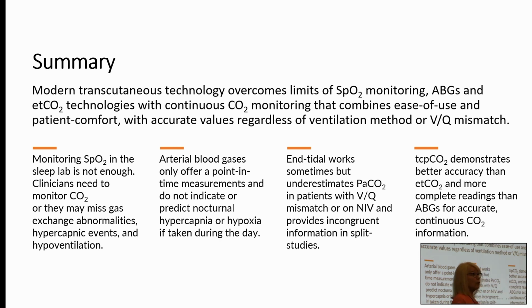If you have a patient who's got skin issues, then that is something to take into consideration when you're monitoring that patient. So it may be that you need to check that site once, or if they're sensitive to any type of heat, you would take that into consideration, just like you would all the other things that you put on your patients. It's not magical. It'd be nice if it was. But yes, you'll have to consider that for those patients.